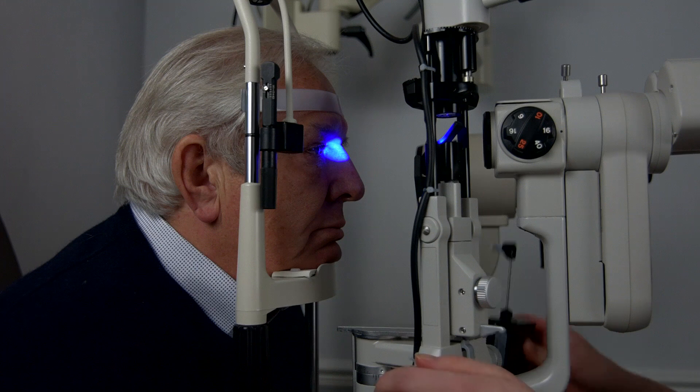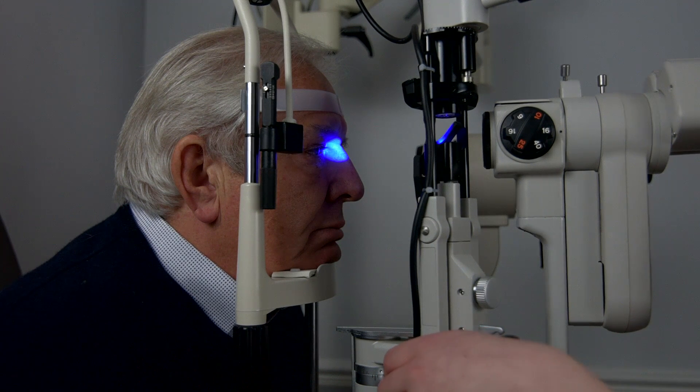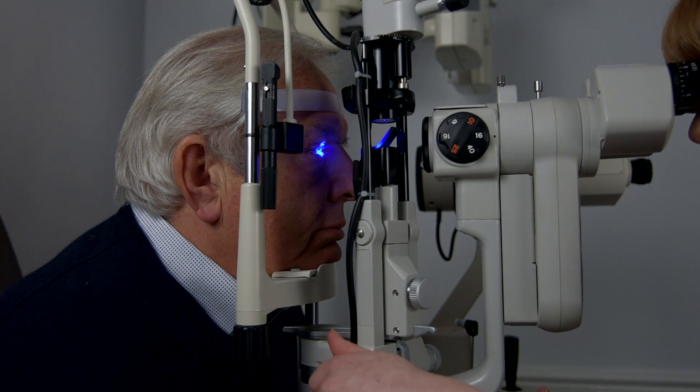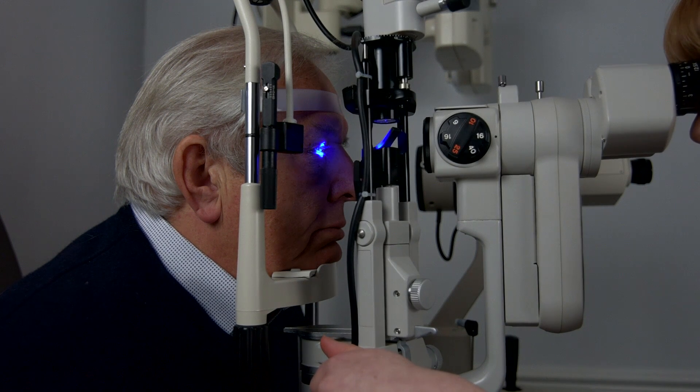And take a couple of blinks again. That's brilliant. You can sit back.